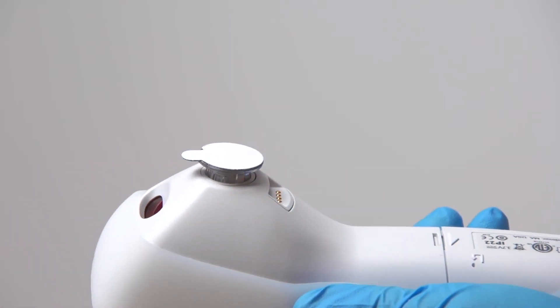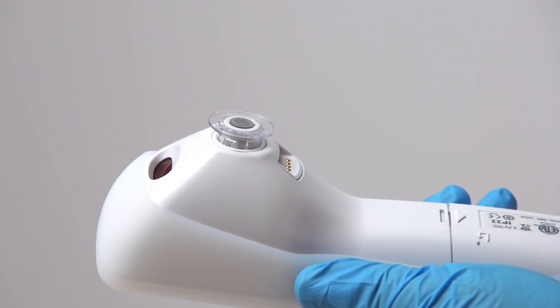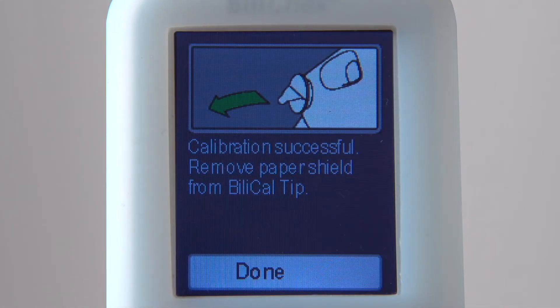To take a measurement, pull on the BilyCal tab and peel away the protective covering and calibration material from the tip and dispose of it. Leave only the clear film on the BilyCal tip. Press the Enter key to select Done.